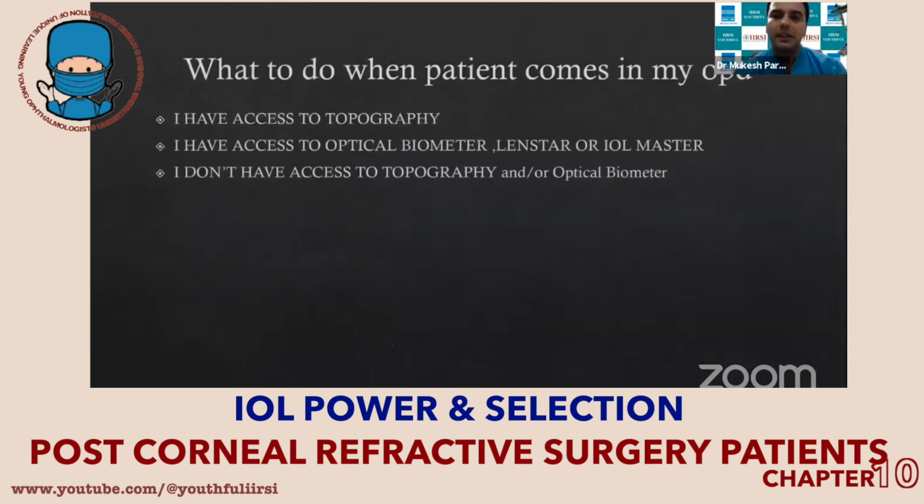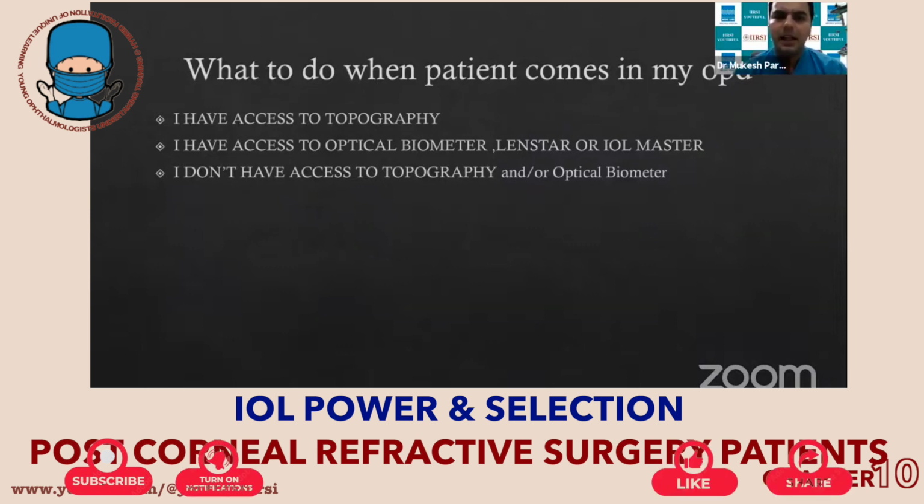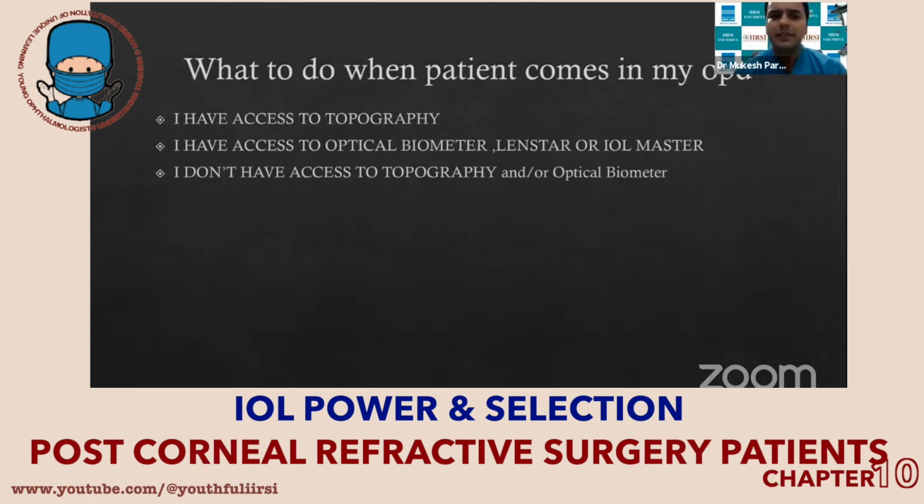Now, coming to this particular point, when I have a patient sitting in front of me in my OPD, the first thing that I ask myself is: do I have access to the topography? Do I have access to the optical biometer or any other biometer, be it LensStar, the IOL Master, or the IOL Master 700? Do I have access to one of these?